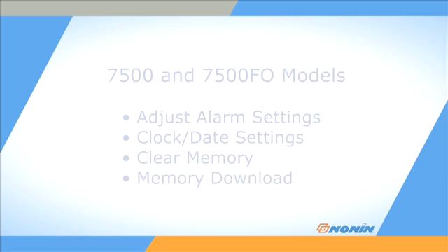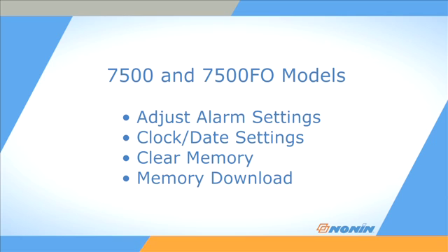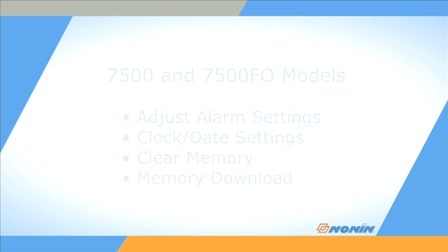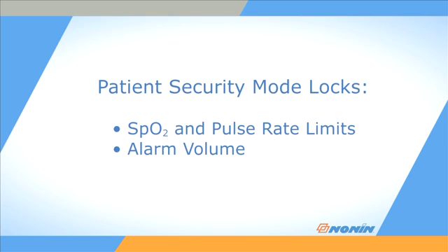Setup is identical on both the 7500 and 7500 FO models. Setup mode is used to set the clock and calendar, adjust alarm settings, clear the oximeter's memory, and perform memory download. Both 7500 model oximeters also have a patient security mode that prevents changes to alarm limits and alarm volume.